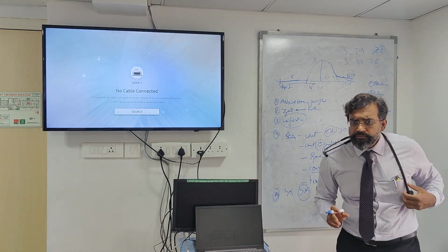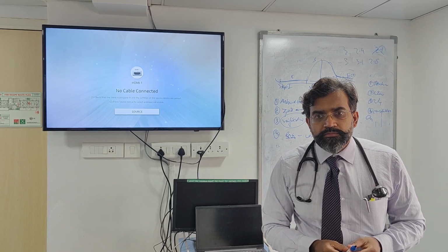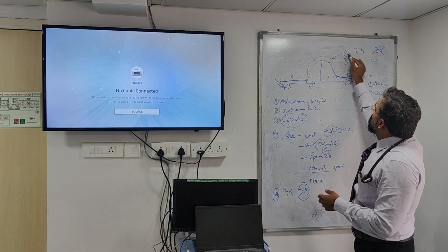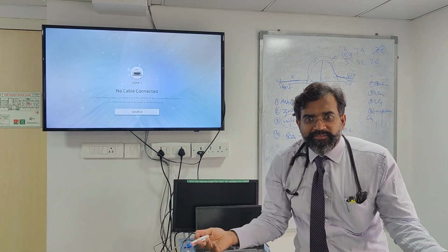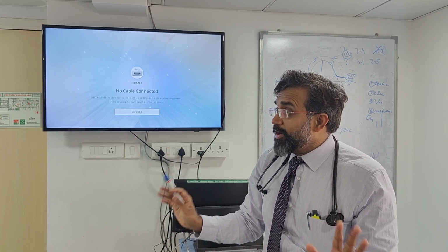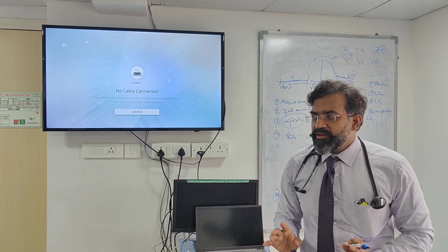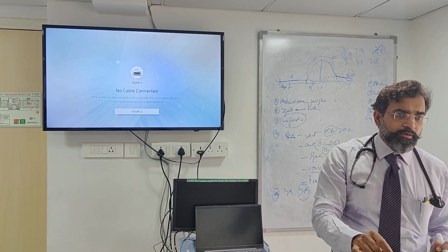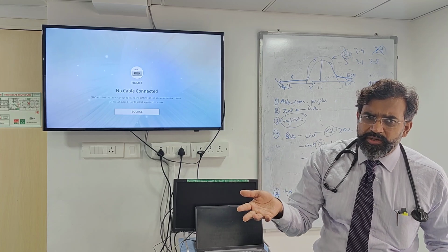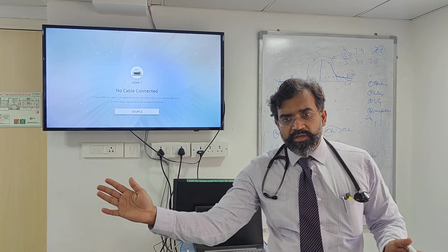Clear on this? Sir, we get lots of values. So which one should we apply the 15% to? Cardiac output. What are we measuring in TPTD? Cardiac output, isn't it? Even extravascular index gives you a good idea if they're not close to each other. No, cardiac output. Extravascular lung water is derived. At that instance you are measuring cardiac output, so it is much easier to look at cardiac output, and there should not be more than 15% variation. Accept that. Then the average that comes is very important.